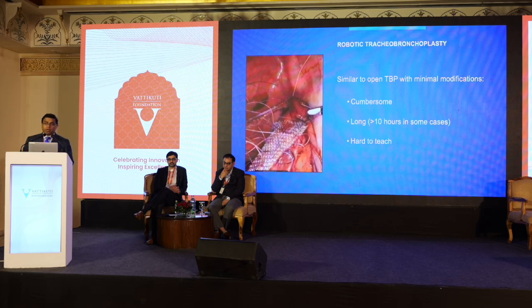Robotic tracheobronchoplasty is obviously an extension of the open procedure. And what has happened is everybody's just tried to copy the open procedure. Unfortunately, this is extremely cumbersome, as you can see in the picture here. It is a shambles of sutures. There are so many sutures. In some cases, they have documented more than 10 hours to do this, especially when you're starting off this procedure. And it is a hard procedure to teach.